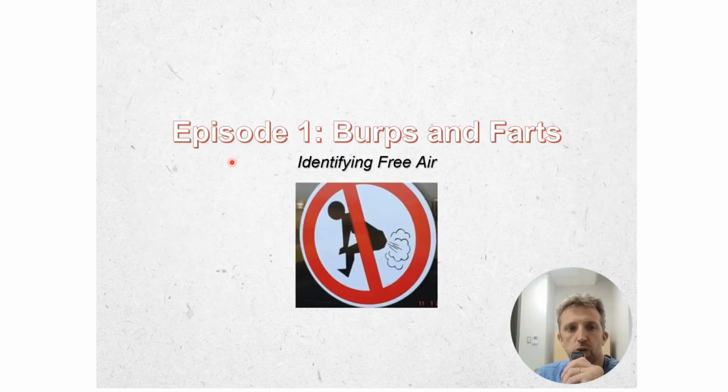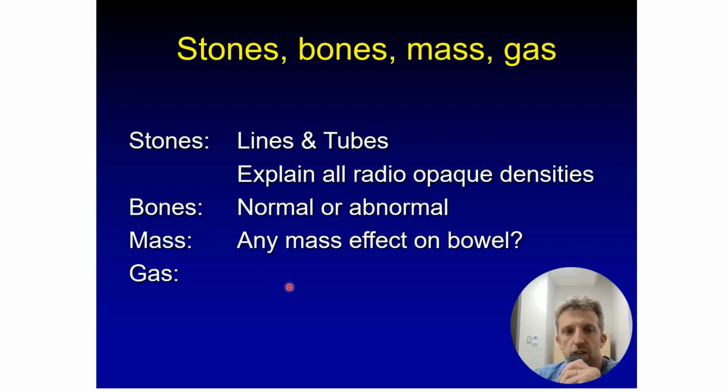And in episode 1, we're talking about the law of burps and farts, looking for free air. We're going to talk about reading an abdominal radiograph. It's important to have a systematic approach. Stones, bones, mass, and gas is how I like to do it.